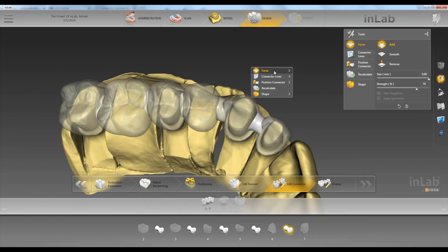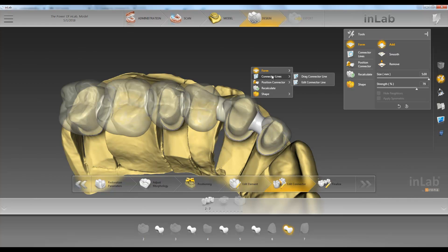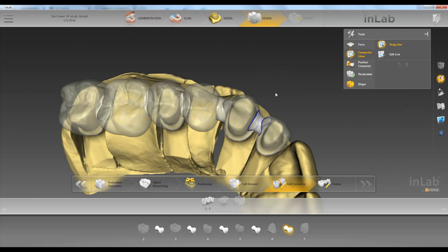Next tool we have is our connector line tool. We have two options here: drag or edit. First we'll go over drag.